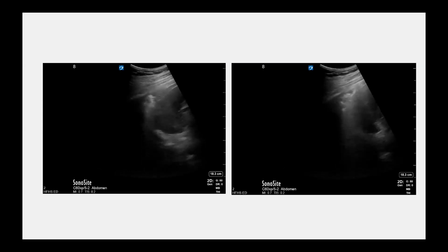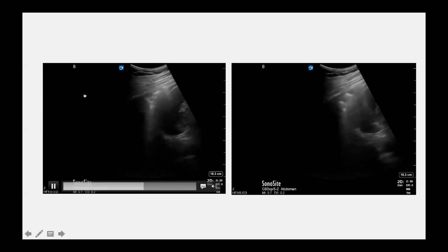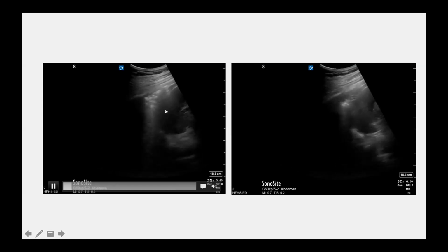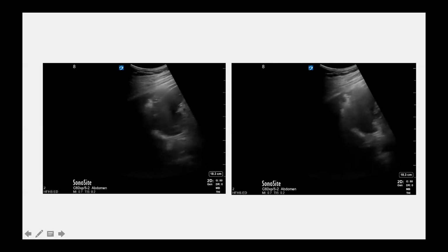Yeah, perfect. Thank you. And the one thing I didn't do that we could have done is, if we had switched to a linear transducer, you probably would see a nice subpleural consolidation as well. And then, as Noor mentioned, yes, you are seeing spleen over here. That's one of your landmarks when you're looking specifically at your diaphragmatic recess. You tend to see spleen more inferior. And then as you go more superior, you have diaphragm coming in and then moving more this way as you go into your thoracic cavity. So like that. And you can also see the parietal pleura, that linear line just below the intercostal area.